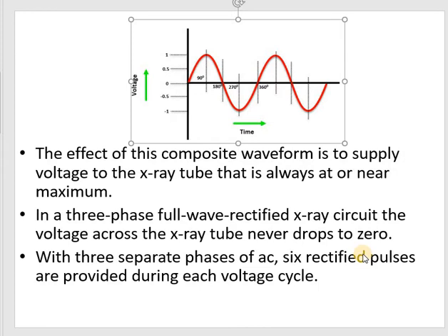A three-phase power supply consists of 3 power wires, or 3 phases. Depending on the circuit, you might not have a neutral wire. In the three-phase power supply, the load of the power is divided into 3.